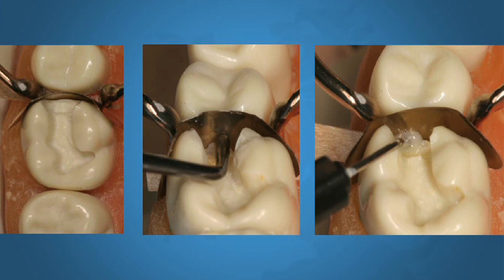If you don't, sometimes you have good contact, sometimes you don't. If you burnish it every time, you're going to have contacts every time. Now, when I say burnish it, I don't mean like the old-fashioned gold burnishing that you spend 5 minutes on. I'm talking about 2-3 passes. Push the matrix toward the adjacent tooth. That's all. You don't need to do it for a long time.